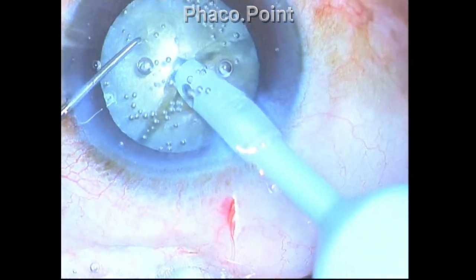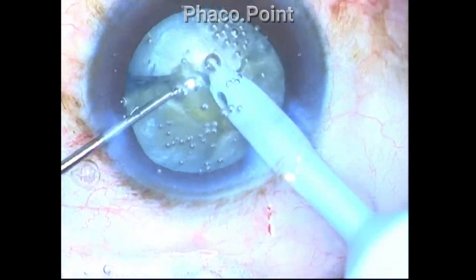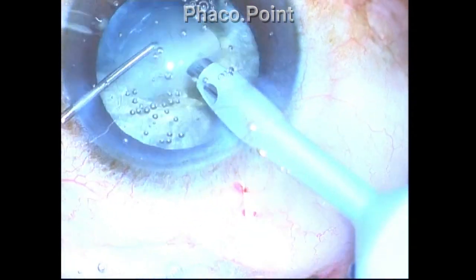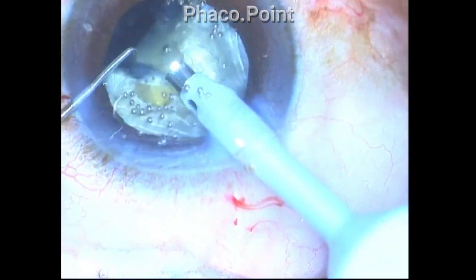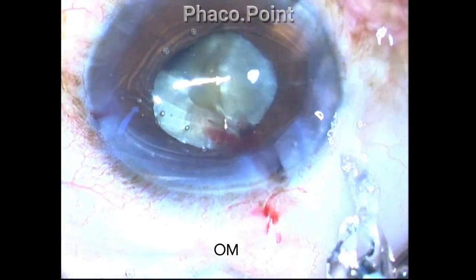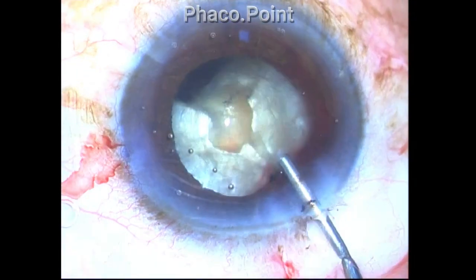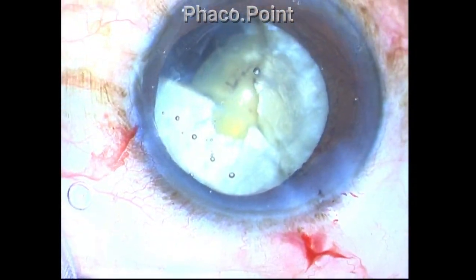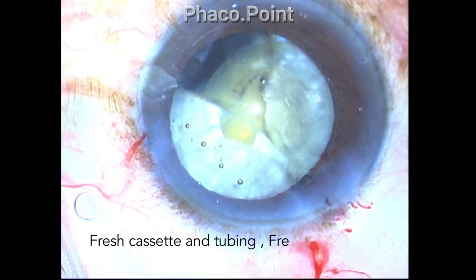The incision was fine. It was neither too tight nor too patulous. The side port incisions were also okay. But because the chamber was unstable, I was under constant pressure while performing phacoemulsification. You see how the chamber is collapsing on me each and every time. At this point, I stopped and I decided to take stock of the situation, change the irrigation line, the cassette and the tubing completely, and change the BSS bottle and the IV set. I also primed and tuned the machine fresh.